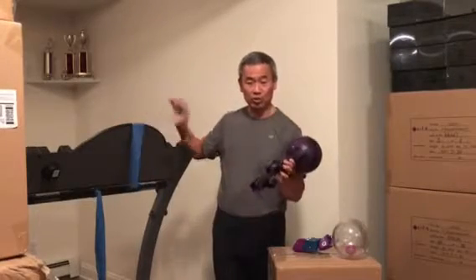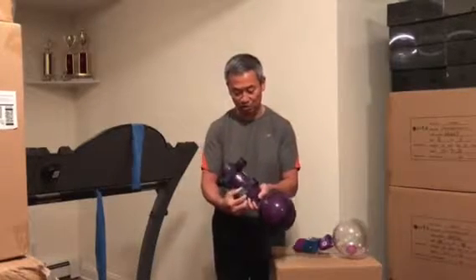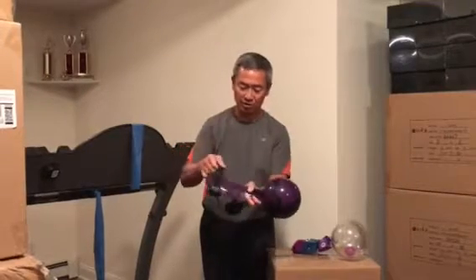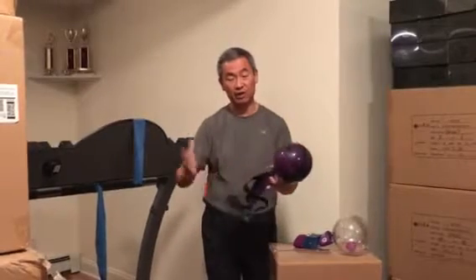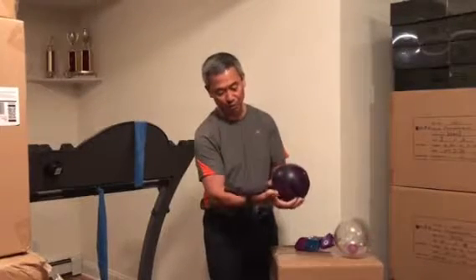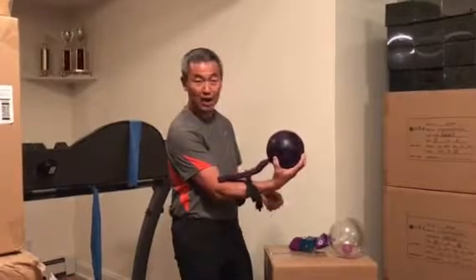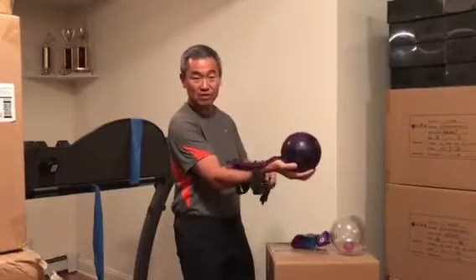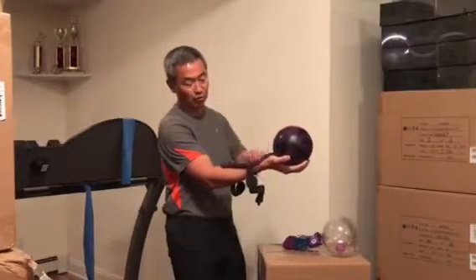When you get the ShoulderSphere prototype, you will see that this is a rubber type of attachment. You would slide this off, take this apart, and the volleyball players, whichever their dominant arm is, you would slide this in with the palm up. So the way they put it on is that you just have the palm totally relaxed. Do not make it tight like this, but make it nice and relaxed so there is complete, perfect contact between the ball and the wrist.